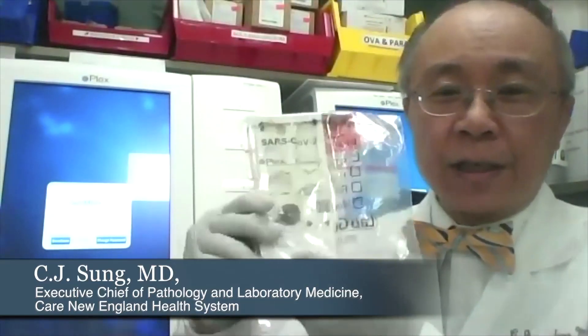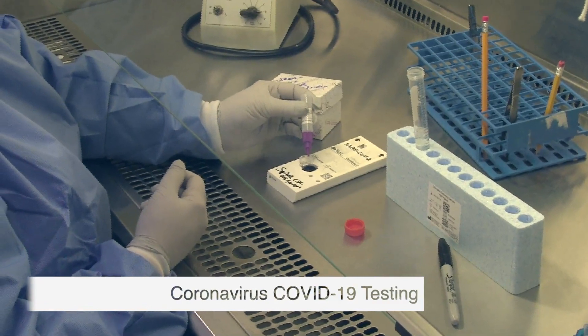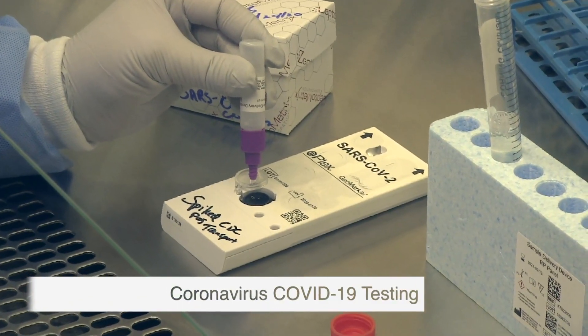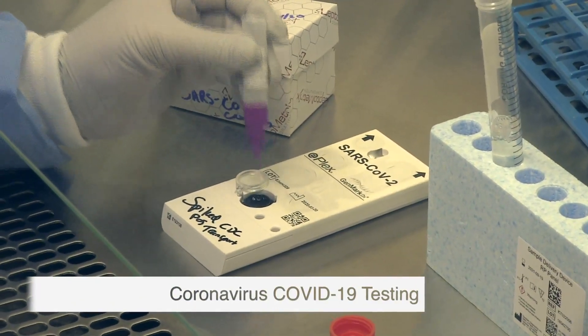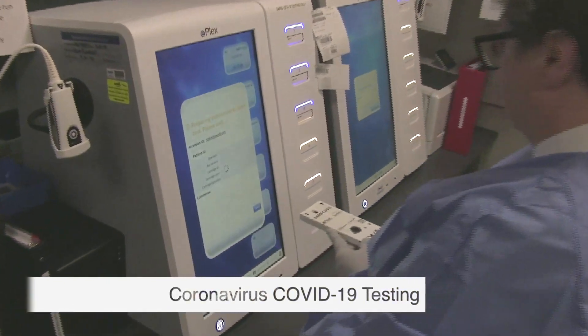This is an instrument that we just acquired last week and it allows us to test specifically for the SARS-CoV-2 virus. This is the kit that we use, where we put a sample into this little dot, and then we put this sample into the instrument into a slot in here.